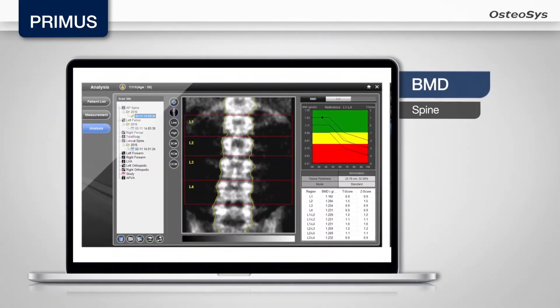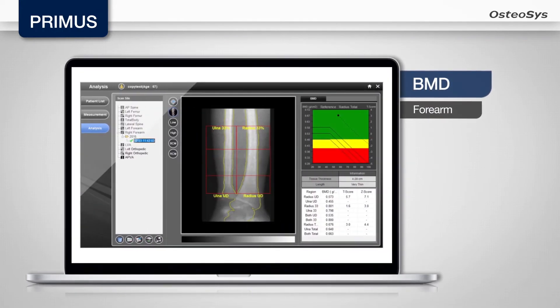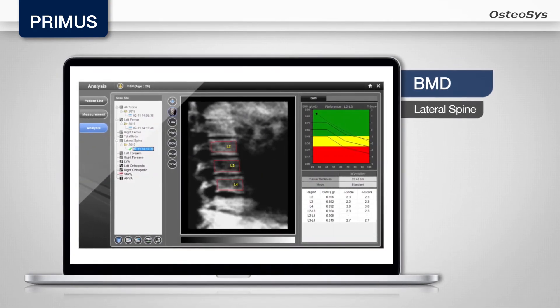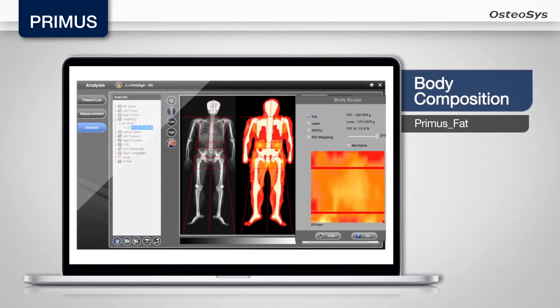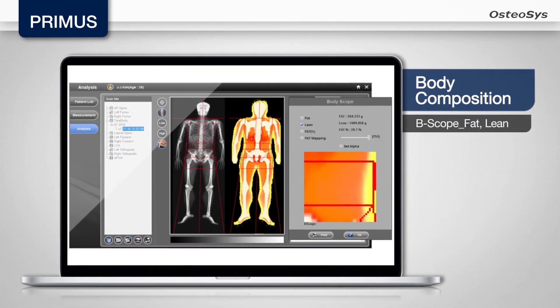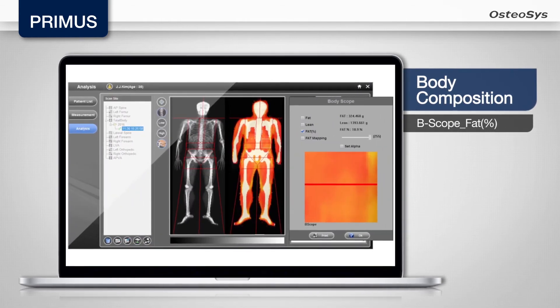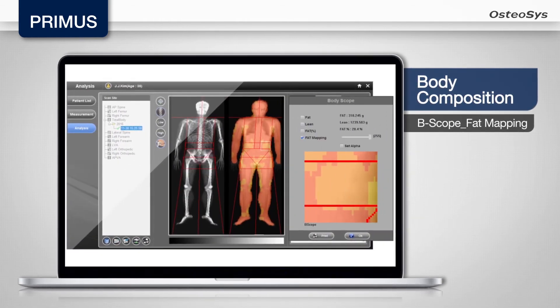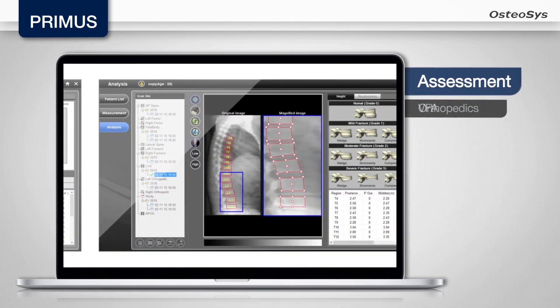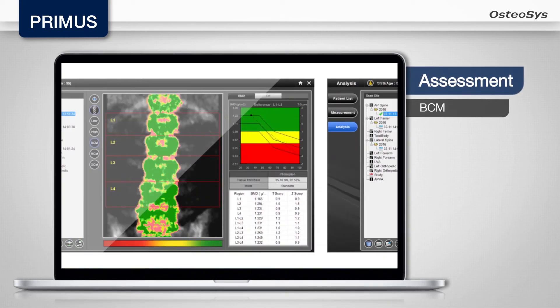Besides the BMD analysis, you can perform various bone morphology analyses by utilizing Osteosis' exclusive high-resolution image analysis functions. The body composition function can quantitatively measure the bone, fat, and lean mass respectively, and calculate the weight of a patient by adding up all the data of these elements. Moreover, it helps the diagnosis of Osteoporosis, Sarcopenia, Obesity, and Lipodystrophy.